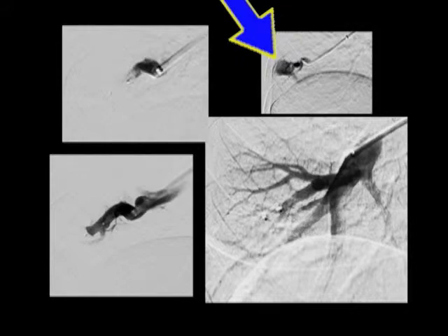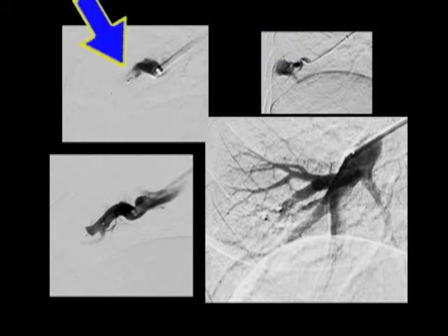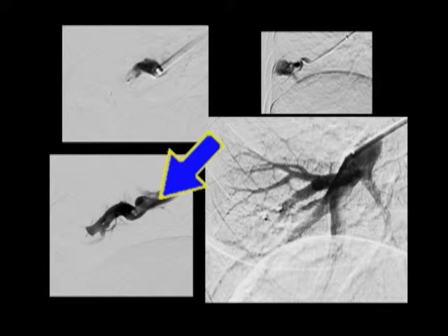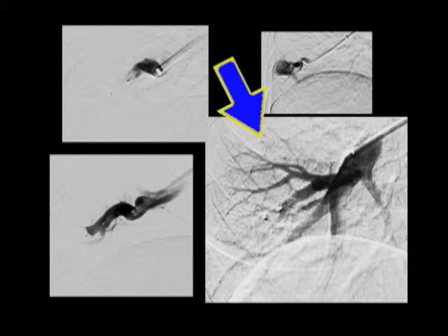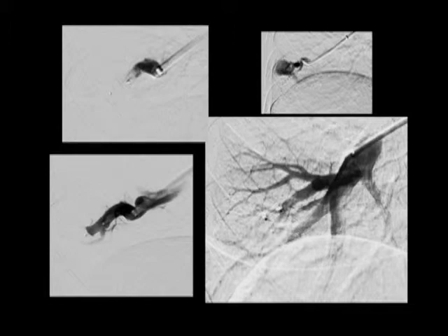There was the AVM, and here is the blockage — you can see it's nicely blocked. The contrast comes there and doesn't go any further. Here's a finished film showing no longer that big round thing which allowed the connection between the artery and the vein.